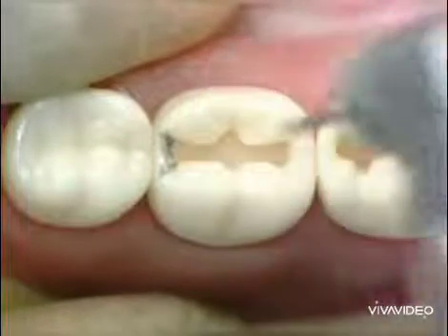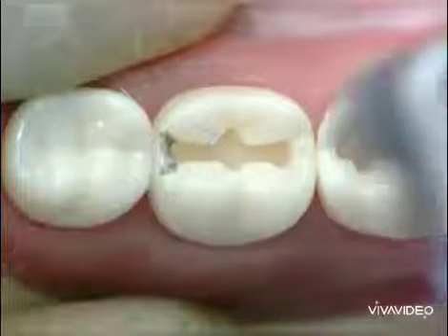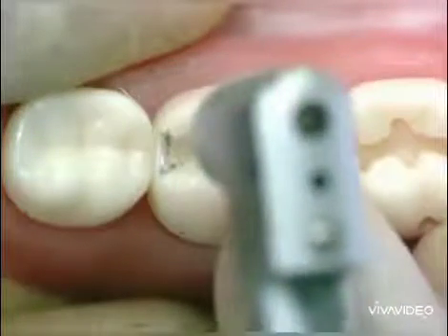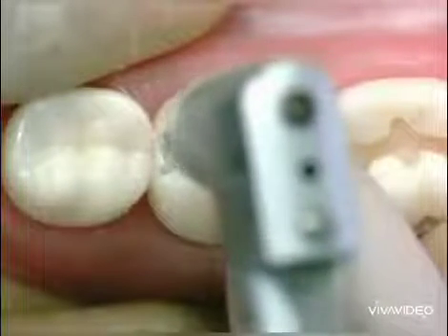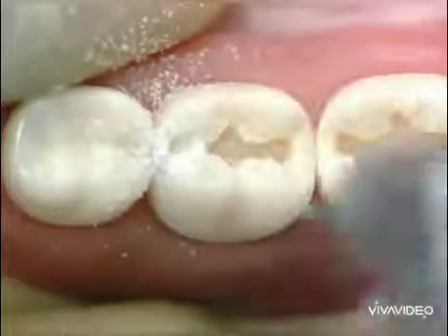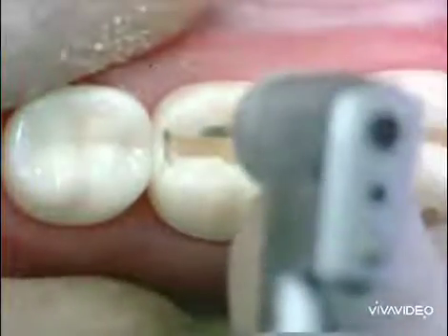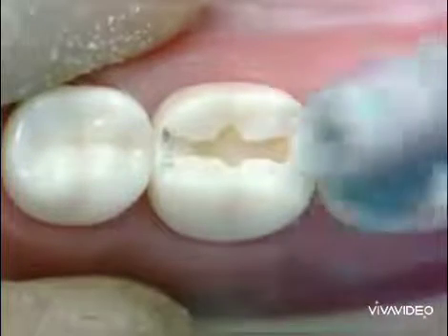Now, with a fisher bur — this is a fisher bur — we will do weakening of the proximal margin of the tooth. We leave a thin shell of tooth structure in order to avoid hitting the adjacent tooth during preparation.